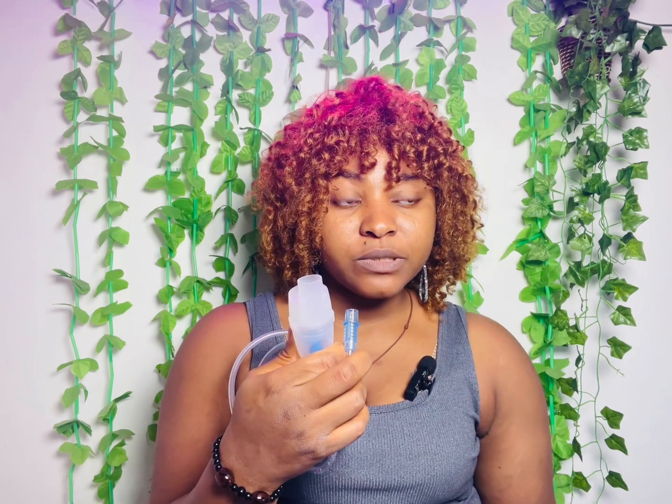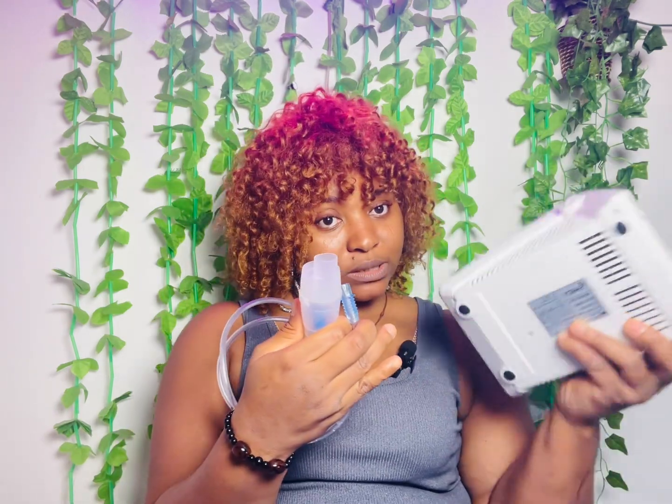This is good, especially for those of us that have severe catarrh, because the day before I got this machine, I was rushed to the hospital because I was having difficulty breathing. So this also helps, and if I had had this at home, I would have used it to assist myself.